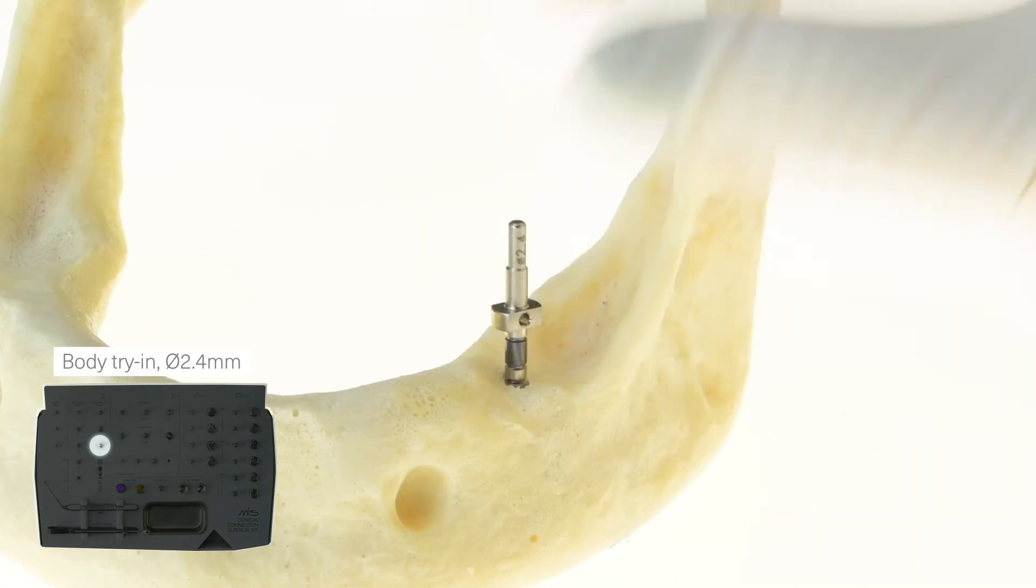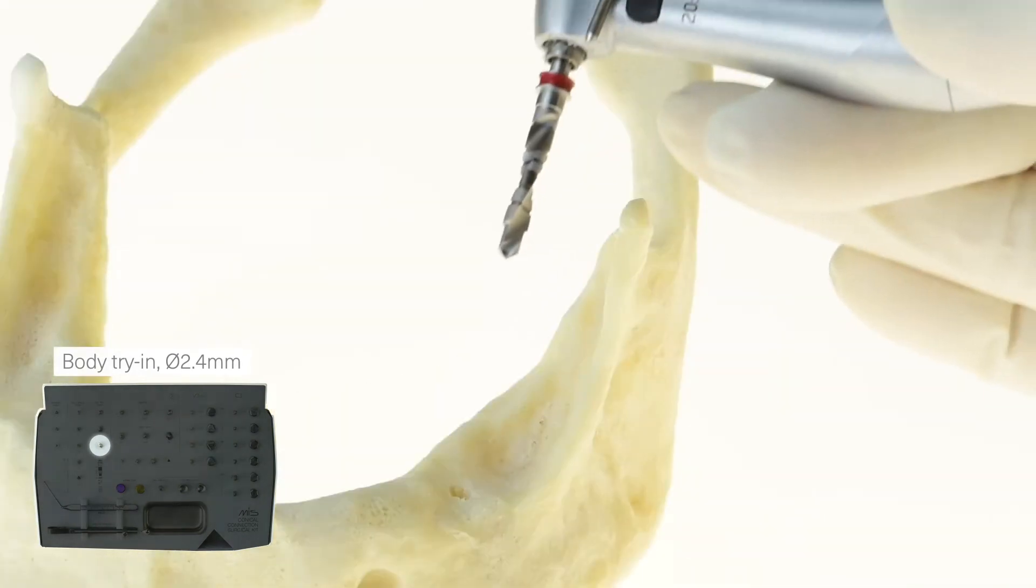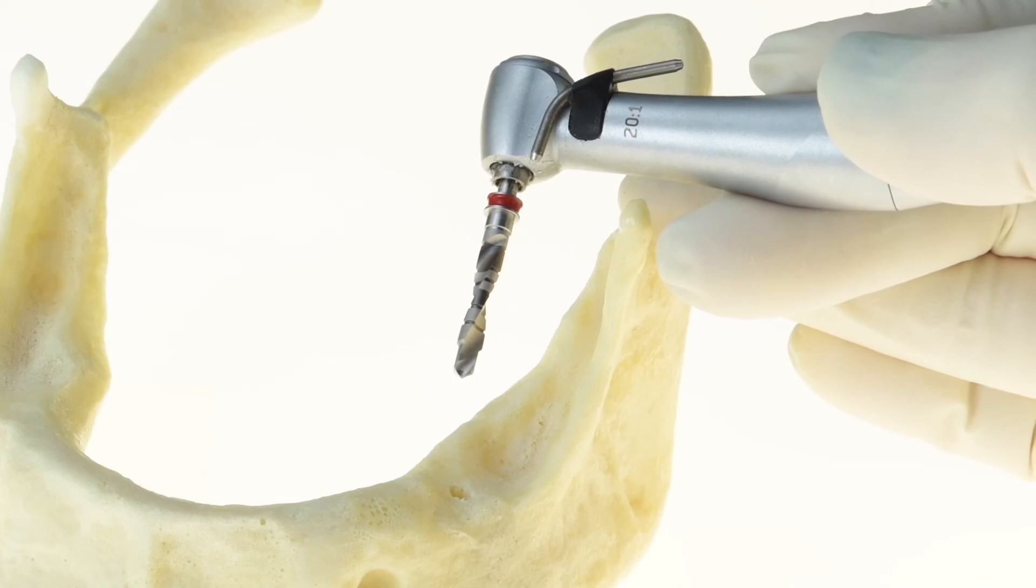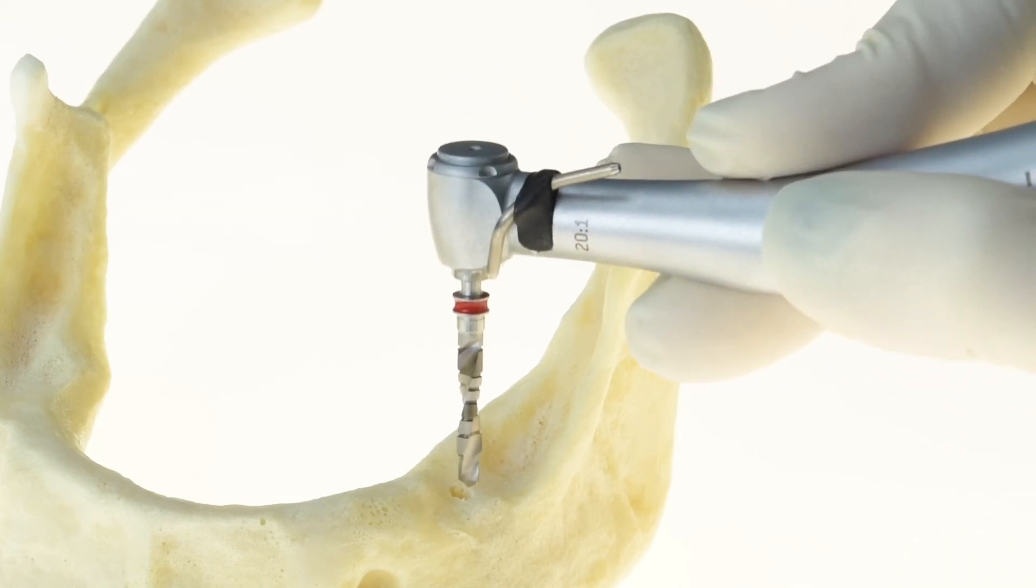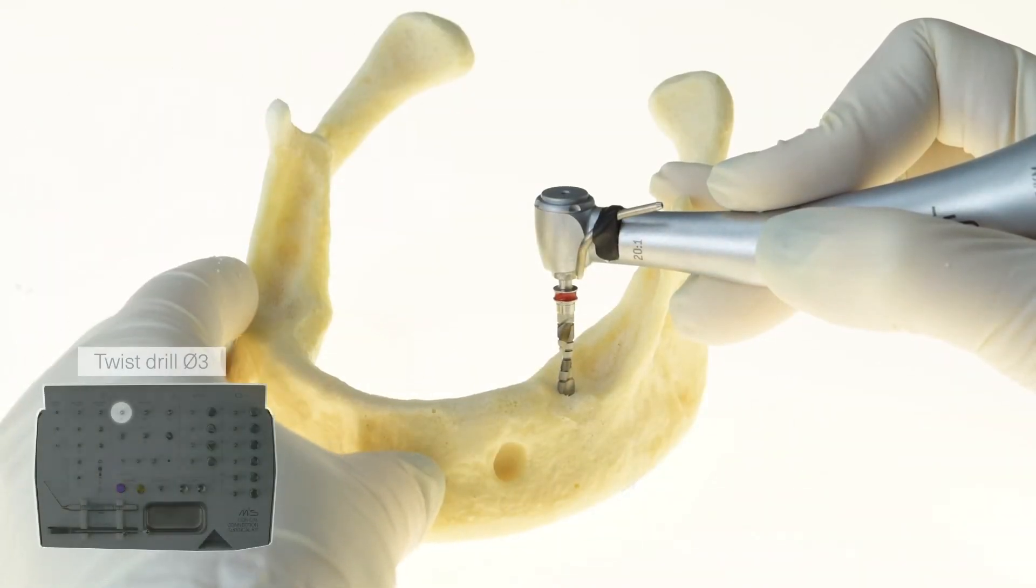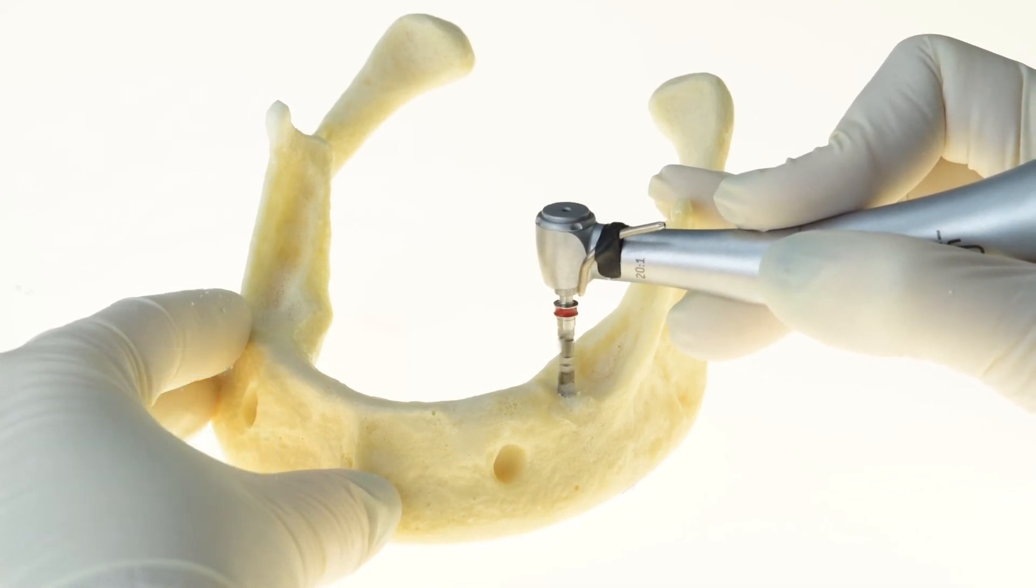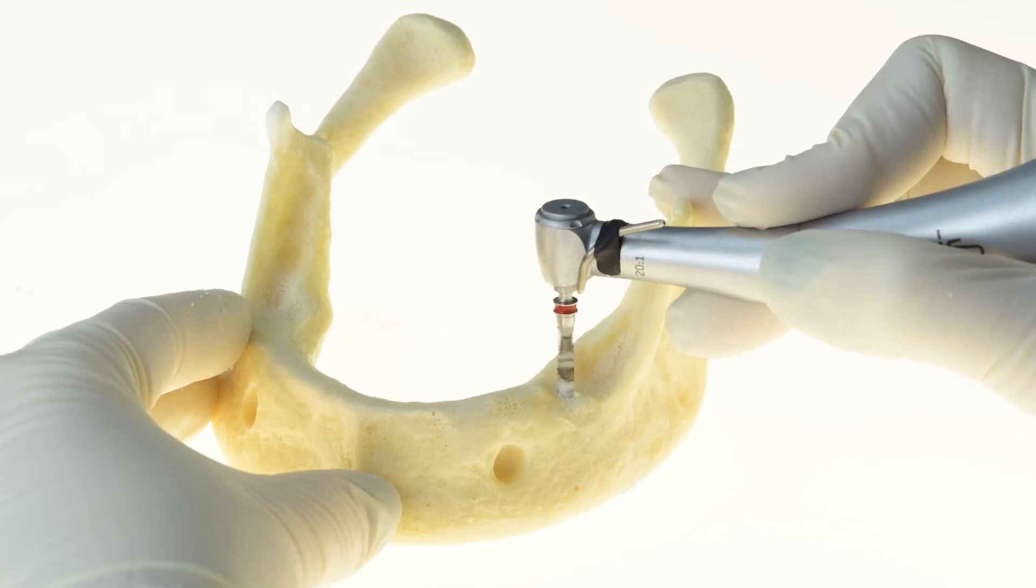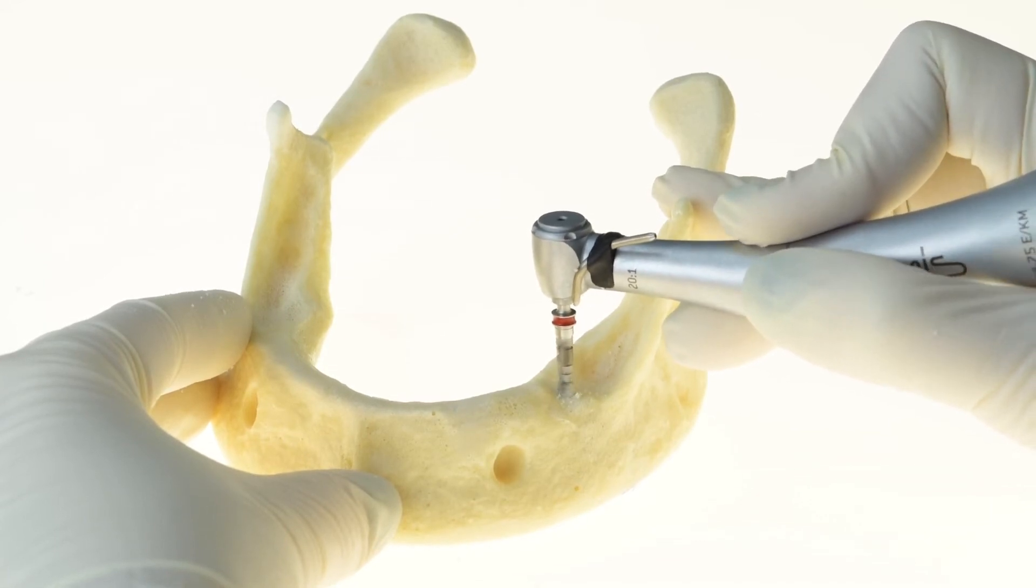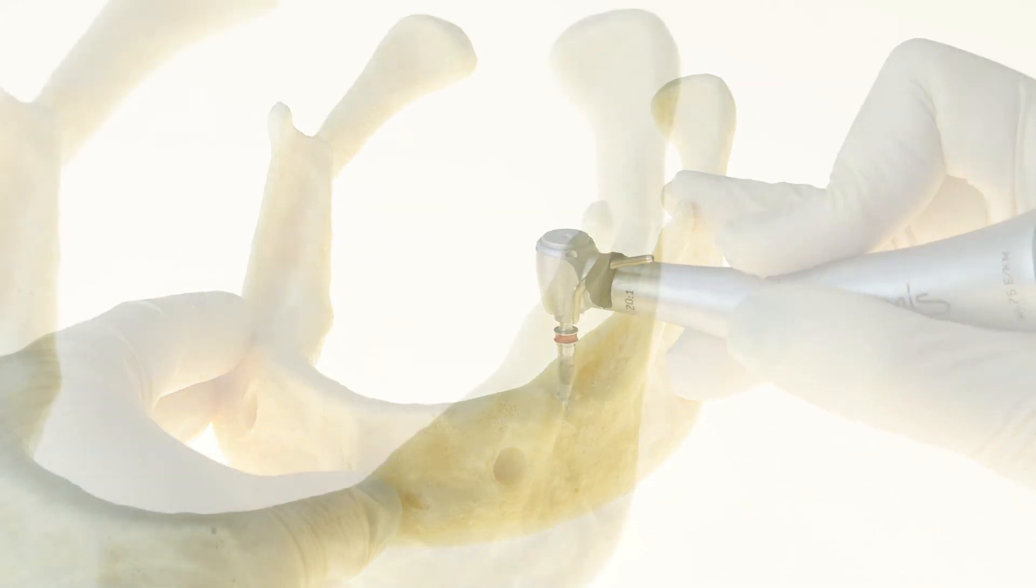Once finished using the pilot drill, a body try-in is used to test the depth. After measuring the depth, we continue to the step drill, drilling until the correct marking. The tip of this drill includes a step which is the same diameter as the previously used drill. This provides a more precise positioning of the drill inside the osteotomy and a more accurate drilling procedure overall.